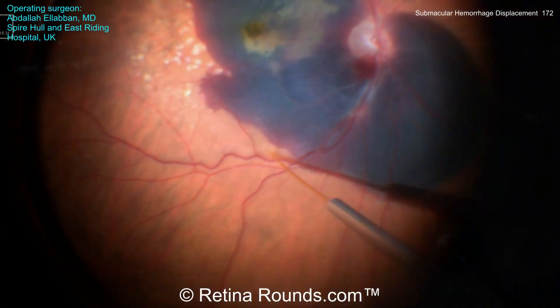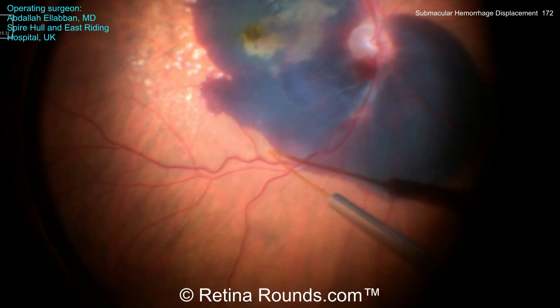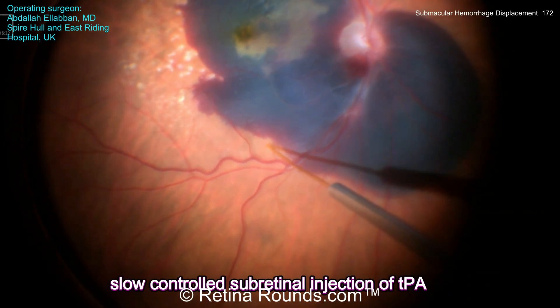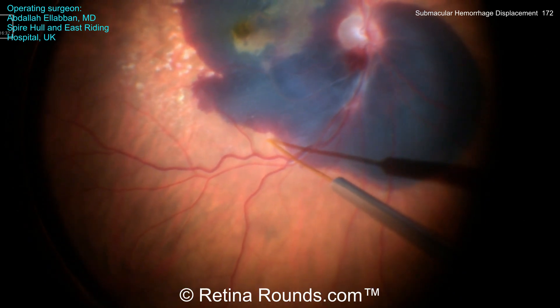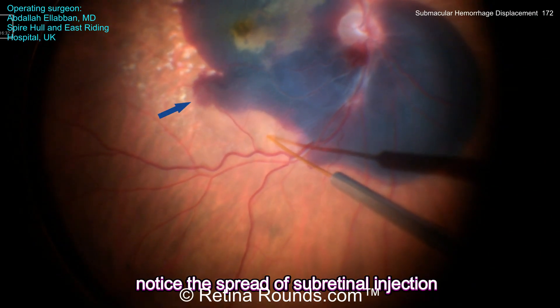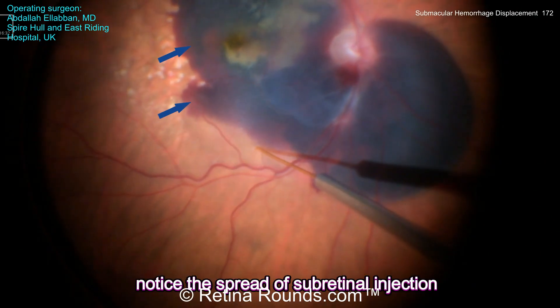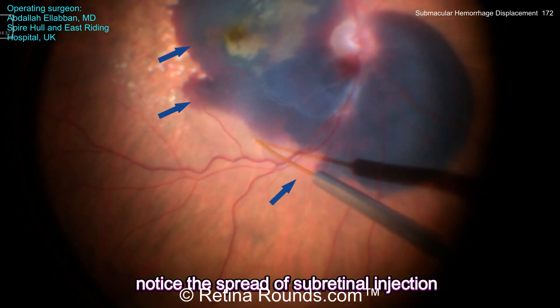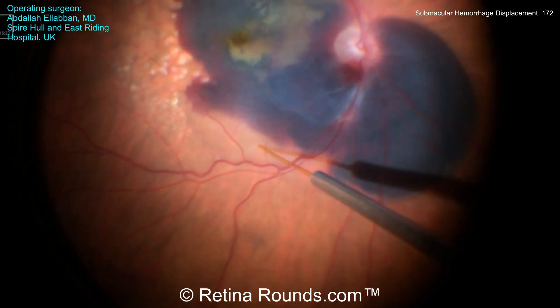This allows him to use a viscous fluid mode on the machine to administer or inject the TPA. Typically, this is going to be at a low PSI, perhaps 10 to 12 to begin with to initiate the bleb. Once the bleb has been created, lowering the PSI to anywhere from 7 to 10 to slowly expand the bubble. You can see here he's dimpled into the retinal surface, with the blue arrows indicating the extent of the subretinal TPA being injected.